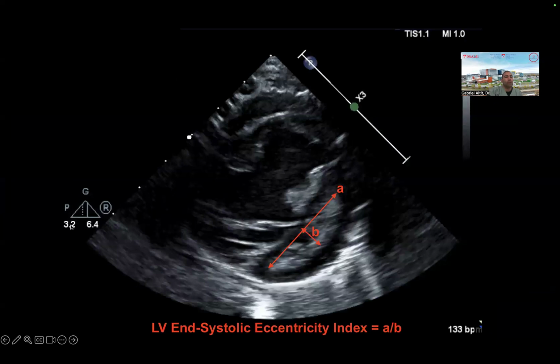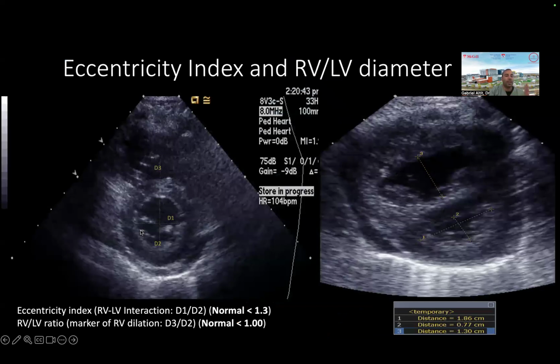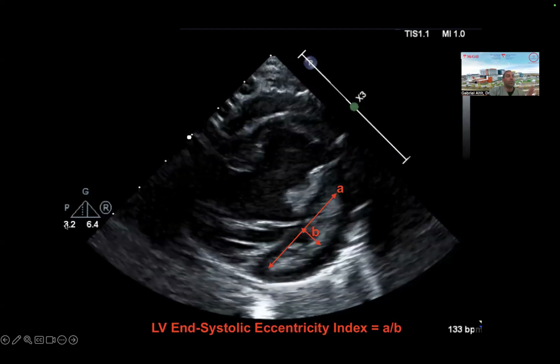Just because I've never shown you that, this little triangle, do you know what this is? No, I just don't. Do you know what this is? No. Okay, so on this image, the information is always there for a reason. What does this tell you?